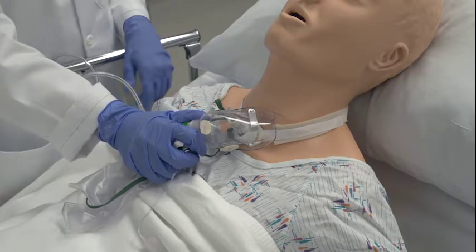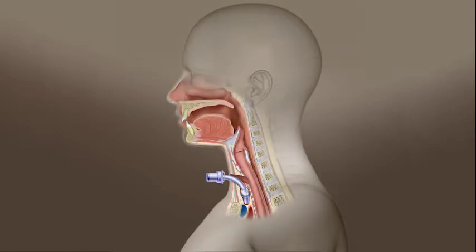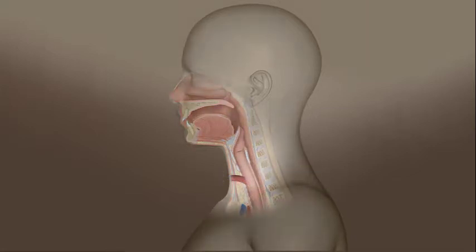If the tracheotomy tube is less than 7 days old, you should wait for the other providers who placed the tube to reinsert the tracheotomy tube. This is because the tract has not fully formed and the risk of placing the trach into the soft tissues in front of the airway, i.e. a false passage, is very high. Once oxygenation and ventilation have been assured, you should prepare to replace the tracheotomy tube.